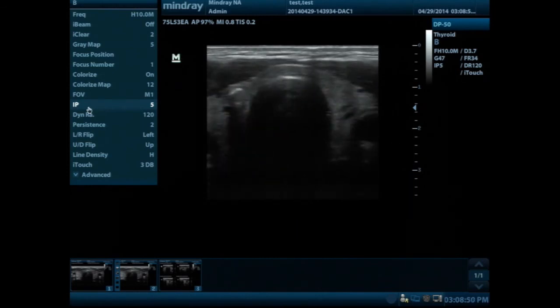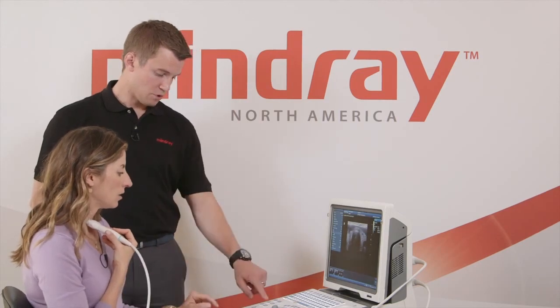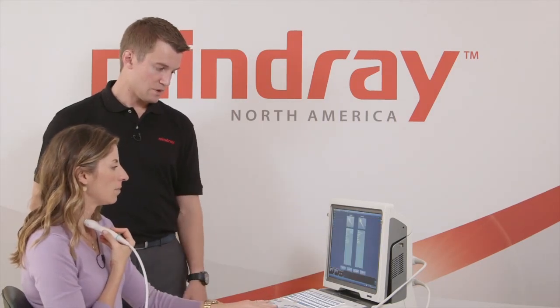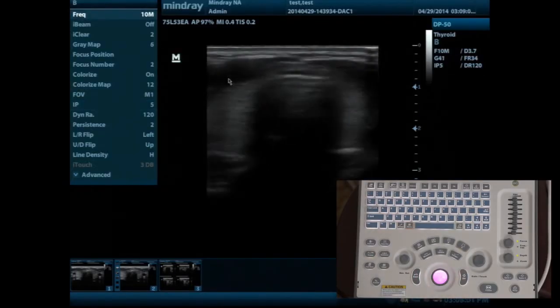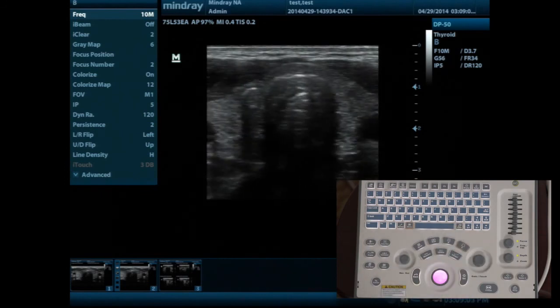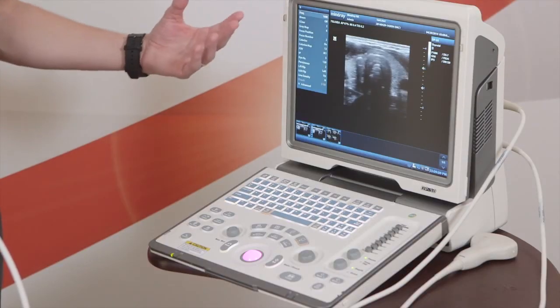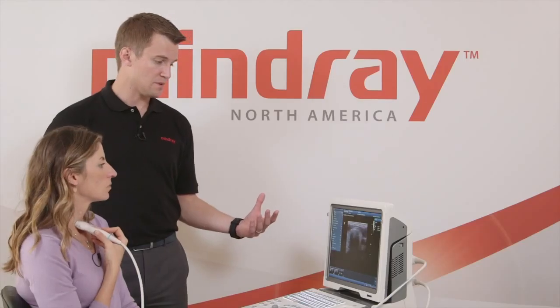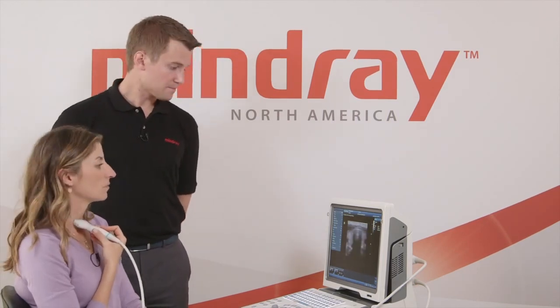And if we start manipulating things way out of whack, we can always go back to our Pro button and reselect, which is always nice. If you do that, it'll bring you right back to the preset home that we had prior to any changes that we made. So yes, definitely on the menu, there are things to look through, and again, the manual is a nice reference guide to see what those might mean, or a quick call or message to your local product specialist. Great.